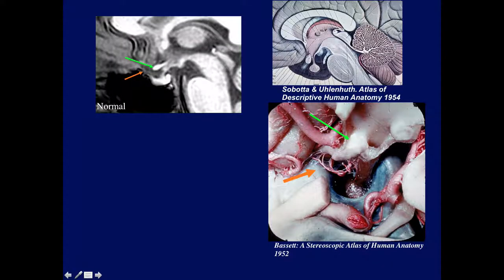On the sagittal view, this is the third ventricle with the massa intermedia. This is the chiasm, which is wedged into the floor of the third ventricle. This is the lamina terminalis — a very thin membrane — so named because in primitive animals without hemispheres, this is where the neural tube ends, the most anterior part of the neural tube. The floor of the third ventricle has the chiasm wedged into it, creating two recesses: the optic recess and the infundibular recess. Then we have the pituitary stalk and pituitary gland.